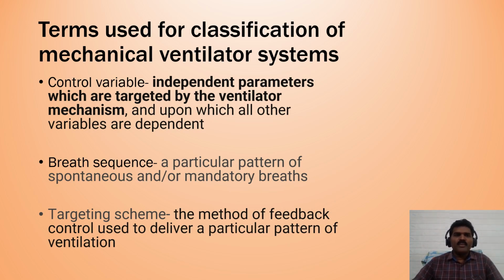Breath sequence: a particular pattern of spontaneous and mandatory breaths is used. You can use continuous mandatory ventilation or continuous spontaneous ventilation or intermittent mandatory ventilation. This is called the breath sequence. Targeting scheme is the method of feedback control used to deliver a particular pattern of ventilation.